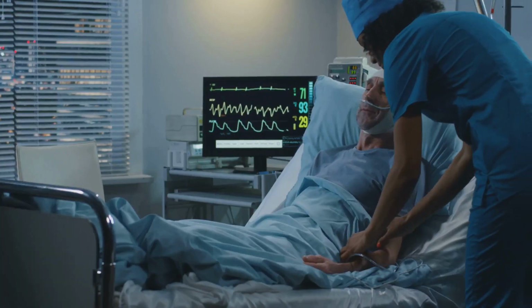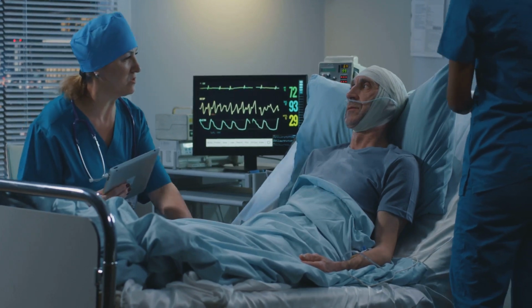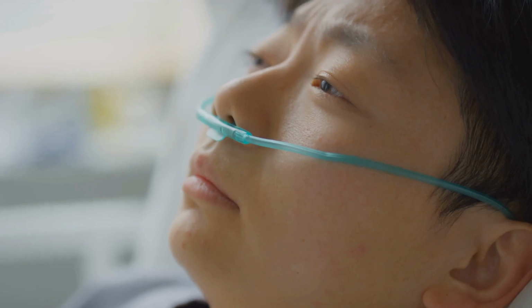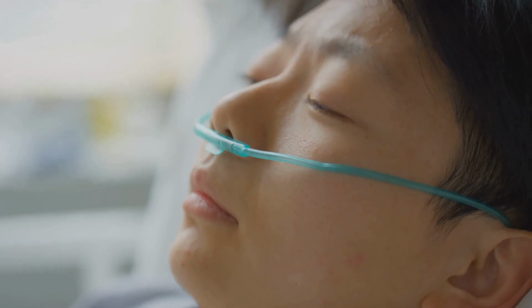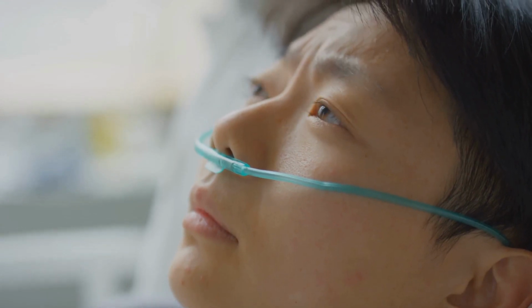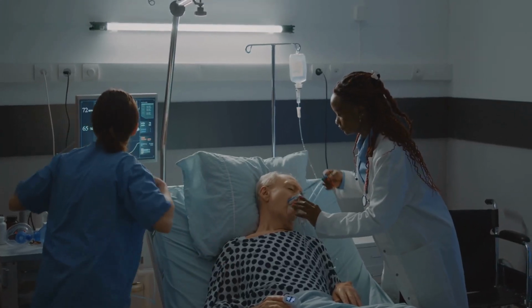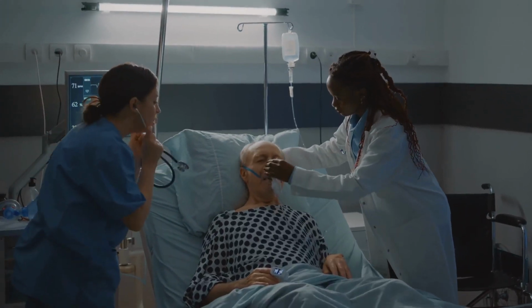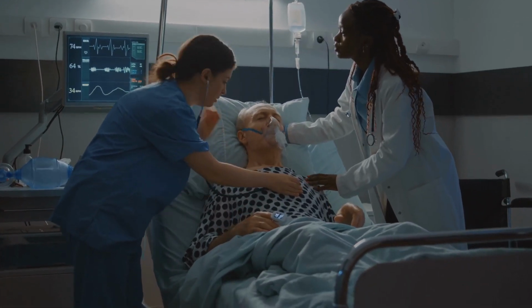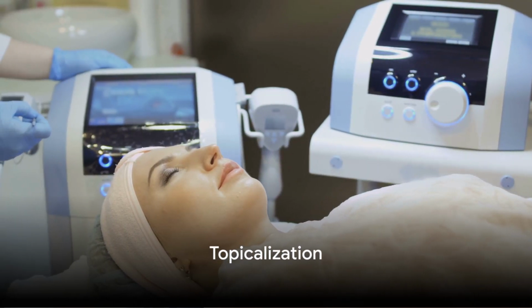Too much saliva can interfere with the procedure, but too little can make the airway dry and uncomfortable for the patient. Also, it's important to note that while antisialagogues greatly assist in awake intubation, they are not without side effects. These can include dry mouth, blurred vision, urinary retention, and in rare cases, confusion or hallucinations. As with all medical procedures, the benefits must be weighed against the potential risks. With the antisialagogue administered, we can now move on to topicalization. Topicalization is a crucial step in awake intubation.